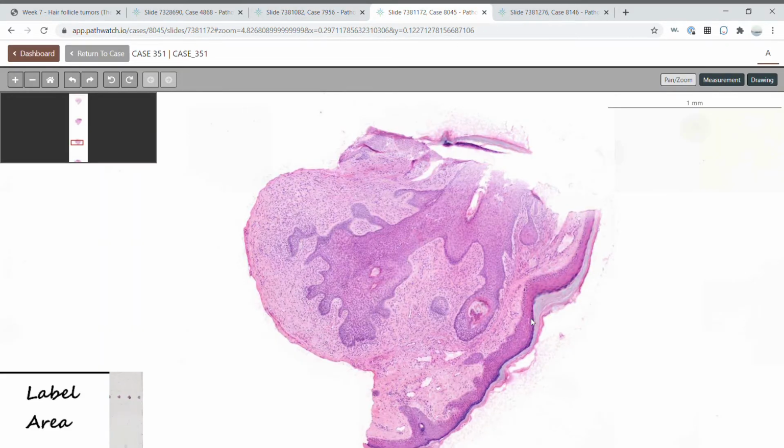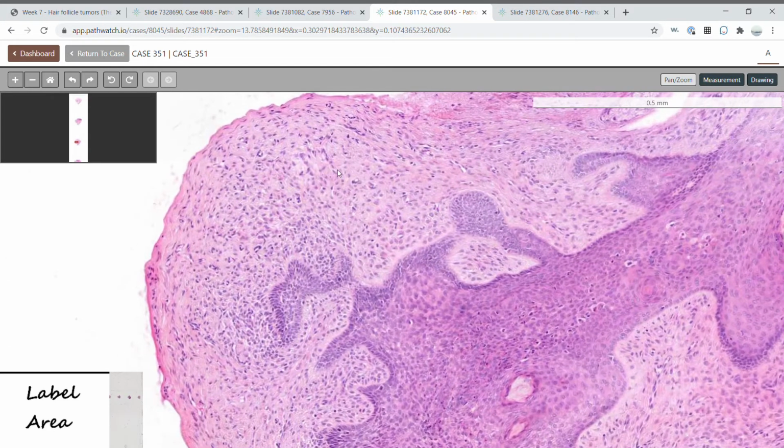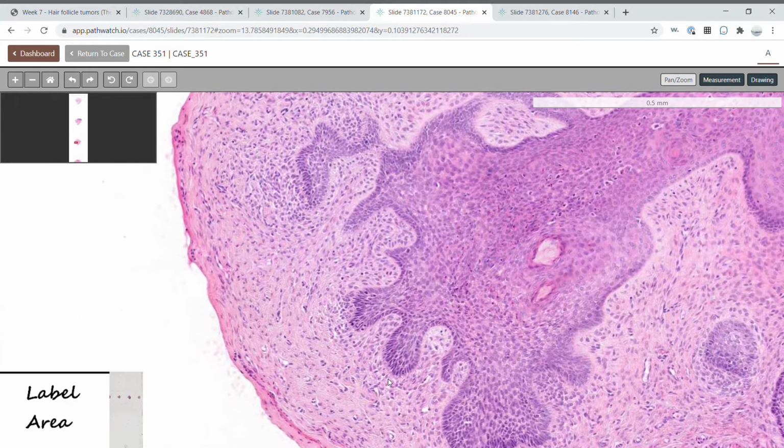Another tumor is the trichofolliculoma, fibrofolliculoma, trichodiscoma spectrum. These are all different stages of the same tumor. Here you can see that there is a central hair follicle with branches of anastomosing epithelium originating out of the hair follicle. In a trichofolliculoma, these are small anagen hair follicles. In a fibrofolliculoma, you can see here a proliferation of fibrous cells or fibrous stroma that sometimes can have a concentric pattern around the tumor. In a trichodiscoma, this fibrous proliferation is most prominent.